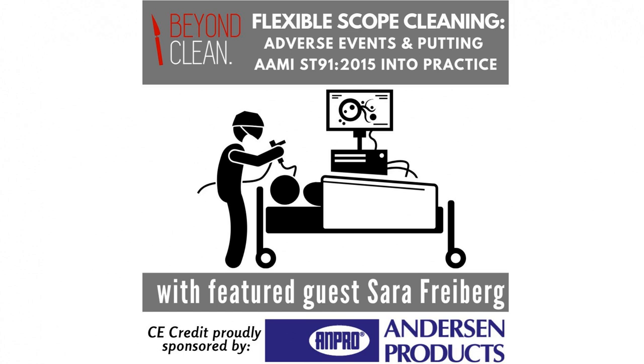In addition, if we miss a leak and fluid enters into the electronic component, angulation wires, or other areas within the scope, those repair costs go up significantly. We all know that fluid and electronics never mix. However, the proper leak testing steps that are required according to the manufacturer are often misunderstood.